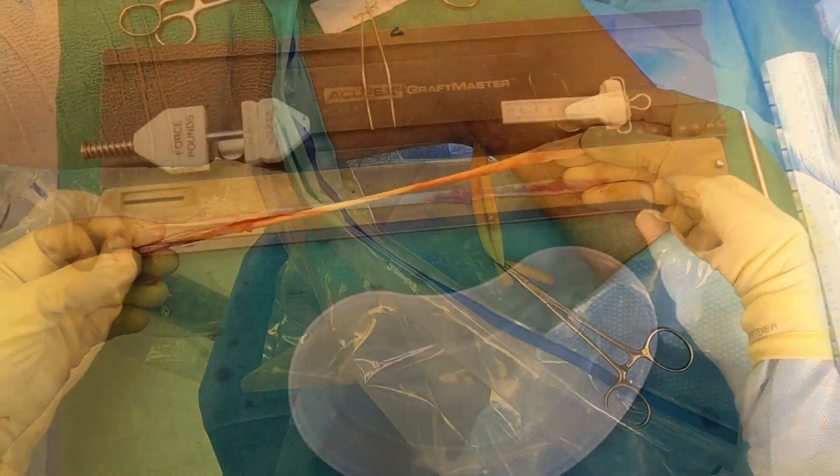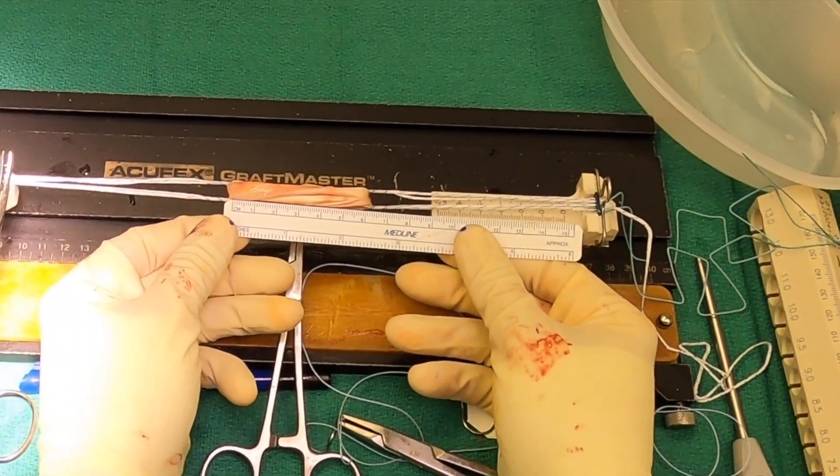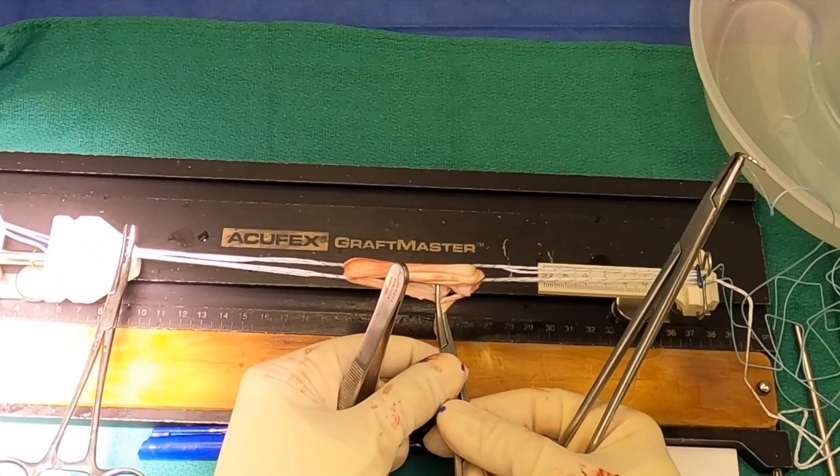Since we're going to do a quadruple loop, we want to have at least 240 millimeters, which will translate into a 60 millimeter graft. I now have both of my endo buttons loaded on the graft master.